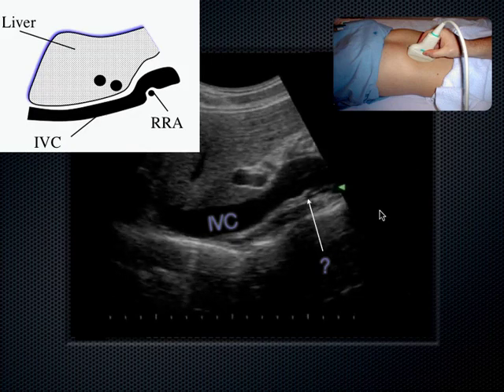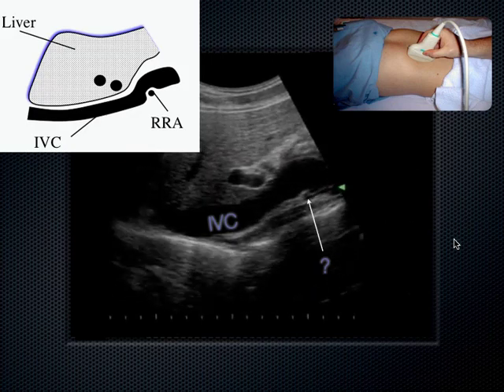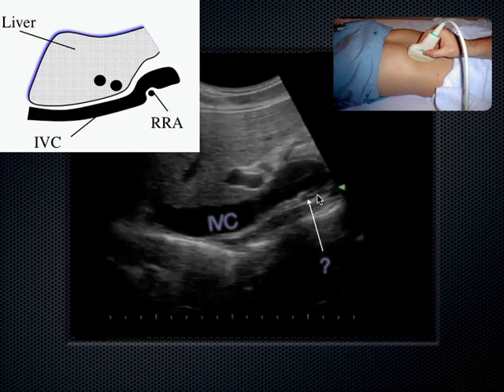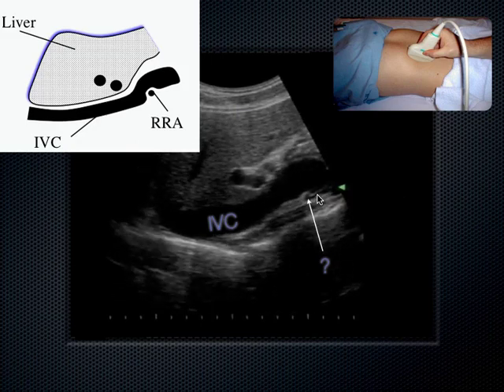And it makes sense because it's coming from the left side of the body to get over to the right side of the body. And the way it does that, it has to go behind the IVC, which is why we see it kind of pooching into the IVC here. I see it on every patient, jumps off the screen. And that way you know what level, if you're at the level of the renals or not.